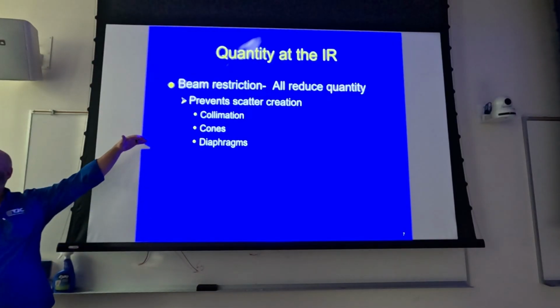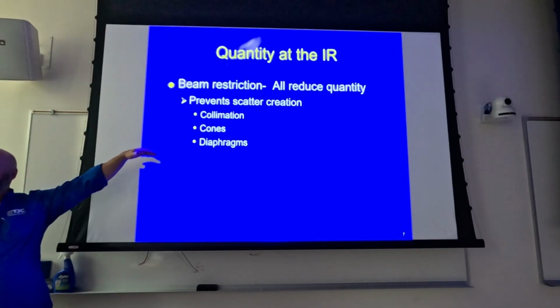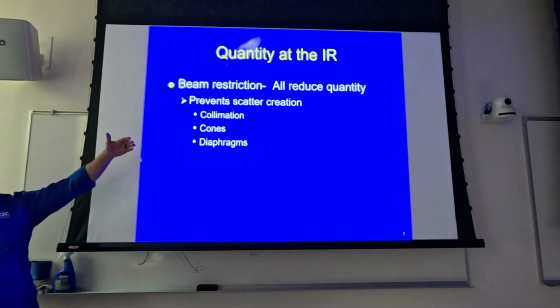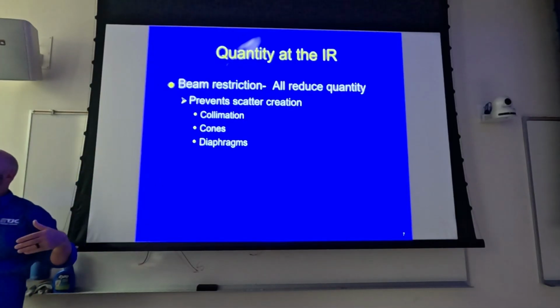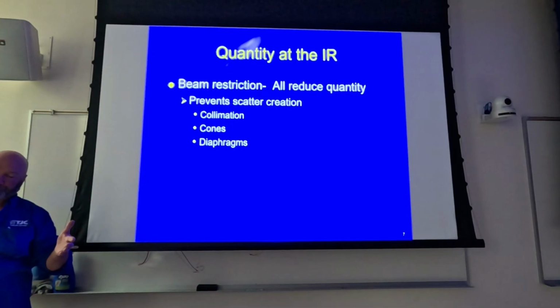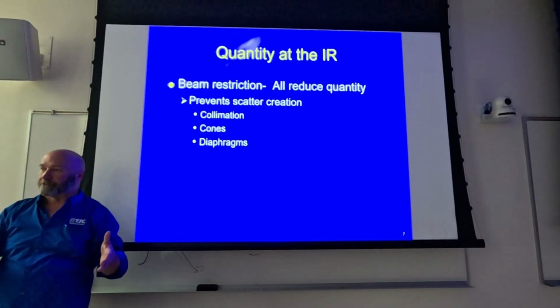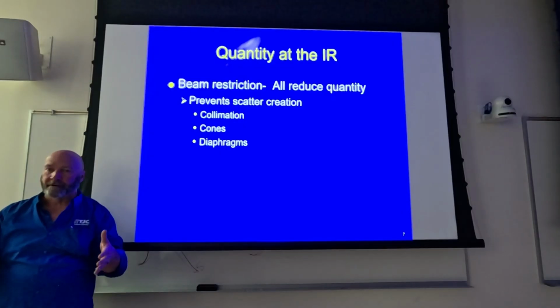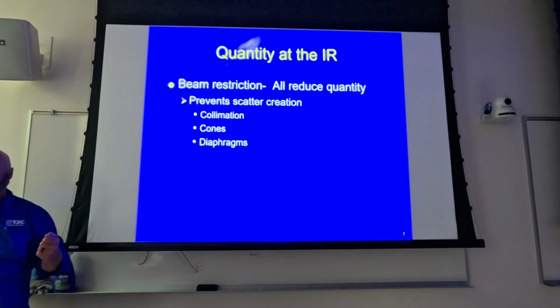You prevent some from interacting in the patient. What's that? It's going to decrease it, exactly. So, you can kind of prove this out at clinicals. Mock yourself up a patient, get you a basin of water, put something in it to represent a bone, make an image of the entire basin of water, and see what your phototimer shoots with.